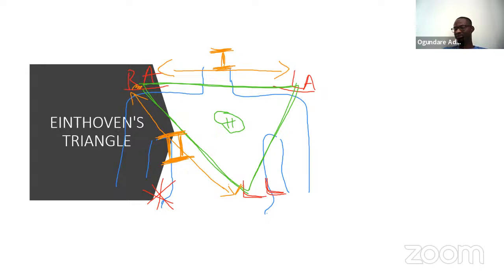You will agree with me that when you see an ECG report or an ECG printout, you are not going to be seeing LA, RA, LL on the paper. Instead, you'll be seeing the leads. So you need to understand how these leads are generated, so you can know where they come from. From the right arm to the left leg is what the system measures as lead 2, and from the left arm to the left leg on this side is our lead 3.